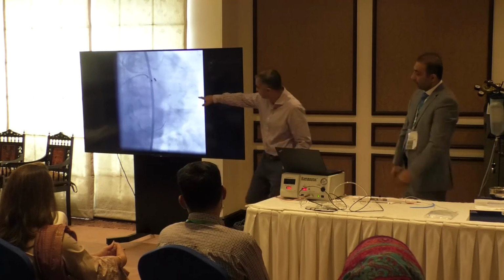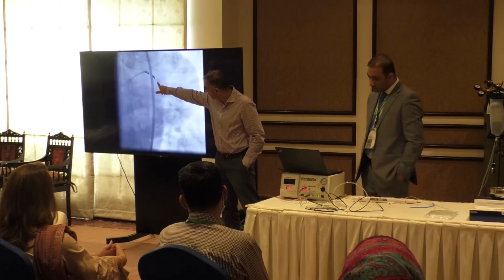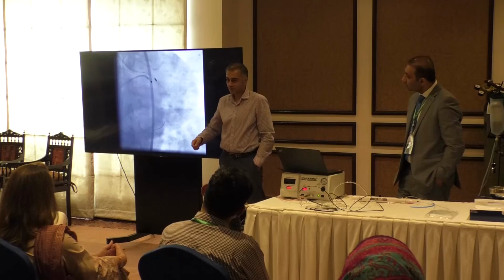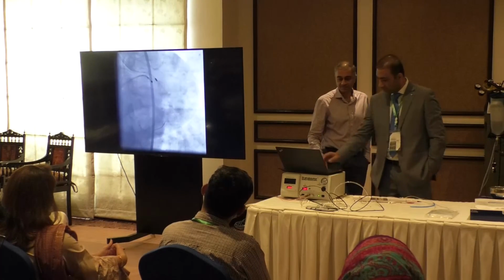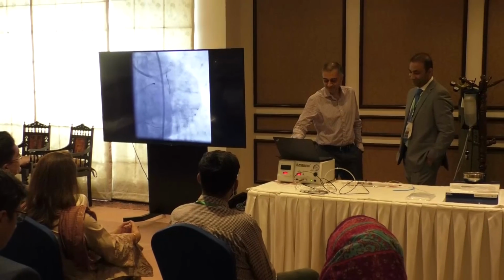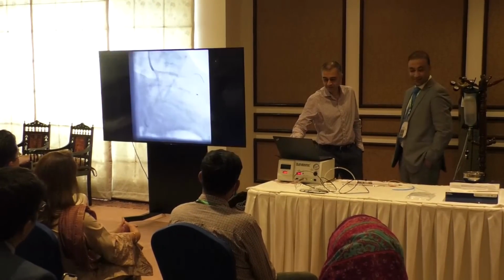So this is the pecking motion. This is quite a large sized burr, and we're just pecking away. As I said, don't just do it in one go. Take your time. How to get out of the situation once the burr has crossed the lesion and you're stuck there? Yeah, we can talk about that once we're in the practical session.